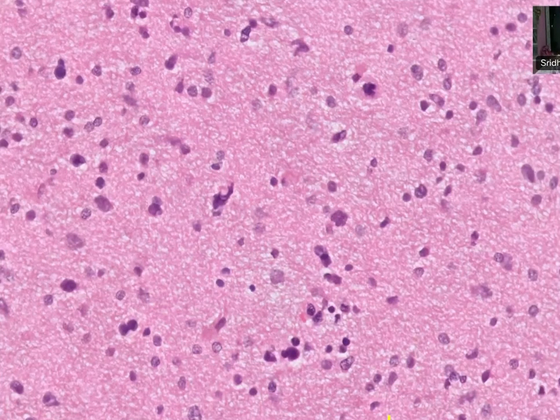It is an adult type, diffuse. So, an older lady presented with a short history, a diffuse glioma. Histologically, what grade? At least grade 3, you can see. Grade 3 or 4? No, sir, it is grade 3. At least histologically grade 3, right? You don't have this thing.